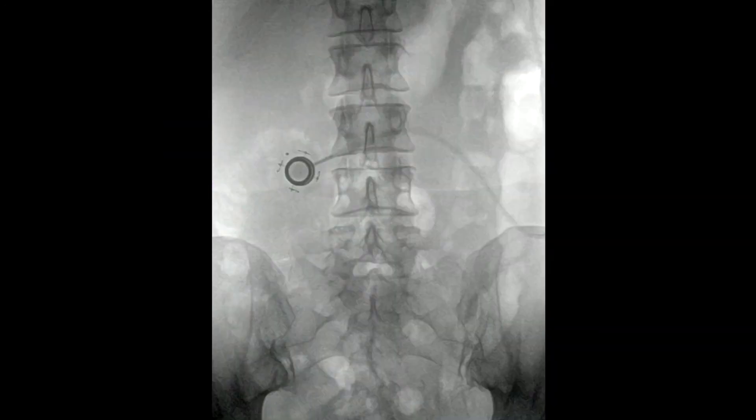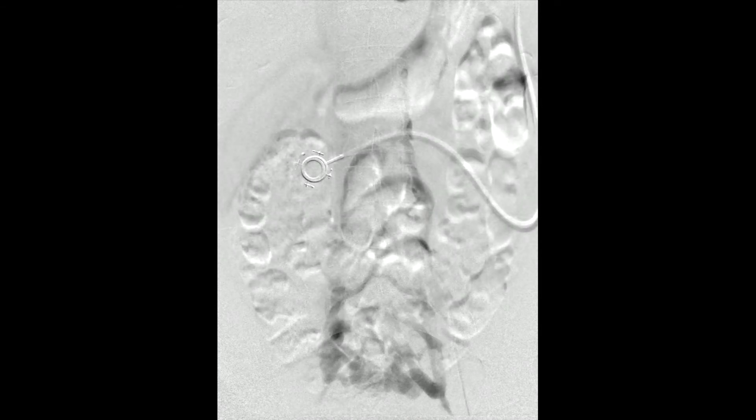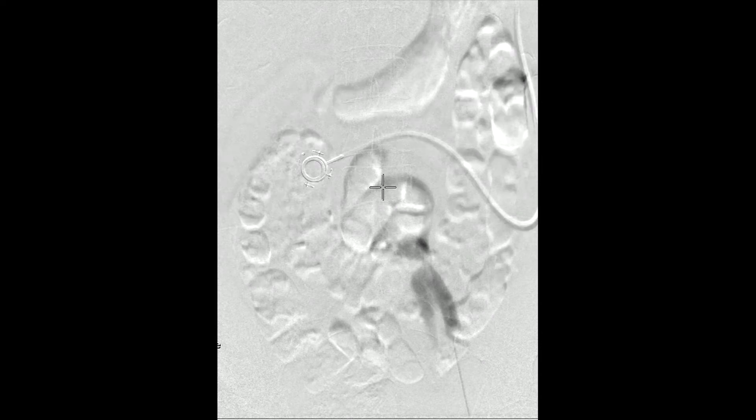Once we have the sheath in place, we will then do an ascending venogram. This is done with a hand injection. Now we're going to see the ascending venogram. It shows that there's very little antegrade flow into the inferior vena cava — it's not completely occluded — with massive presacral and paravertebral collaterals.